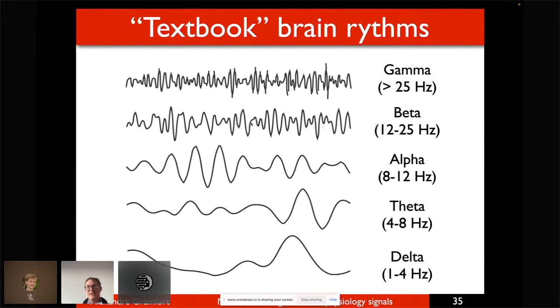And then you have the alpha, and beta. Let's not say too much about beta for now, but alpha is something that we typically saw in the picture from David Cohen, where you had eyes open and eyes closed. And here, delta would be lower, like 1 to 4 Hertz. And typically in the anesthesia data, you will have some strong delta components.